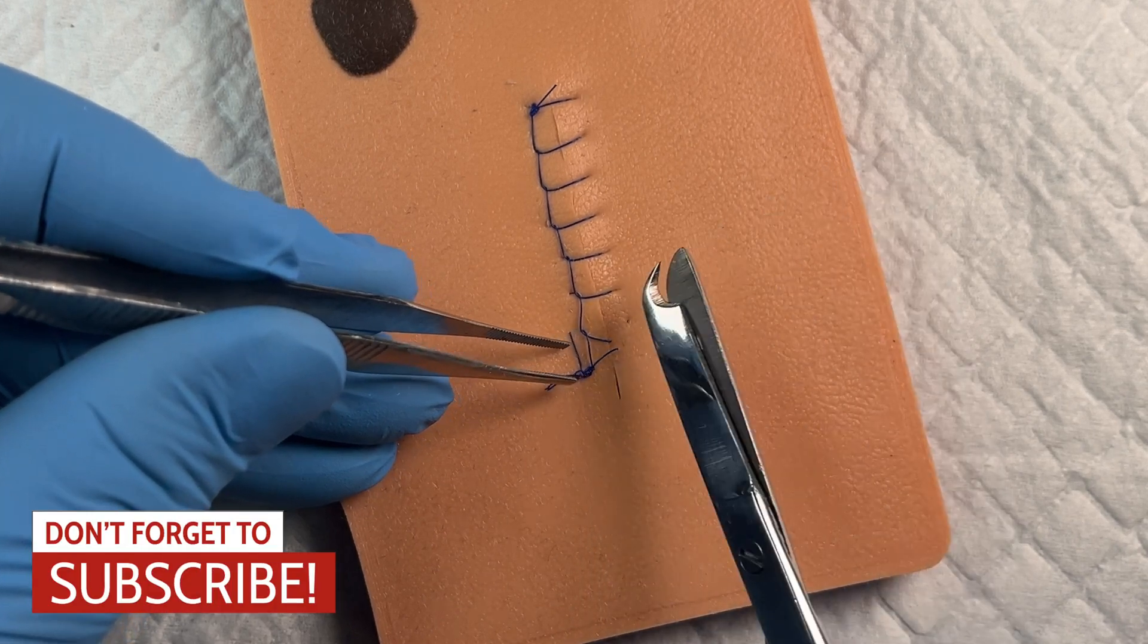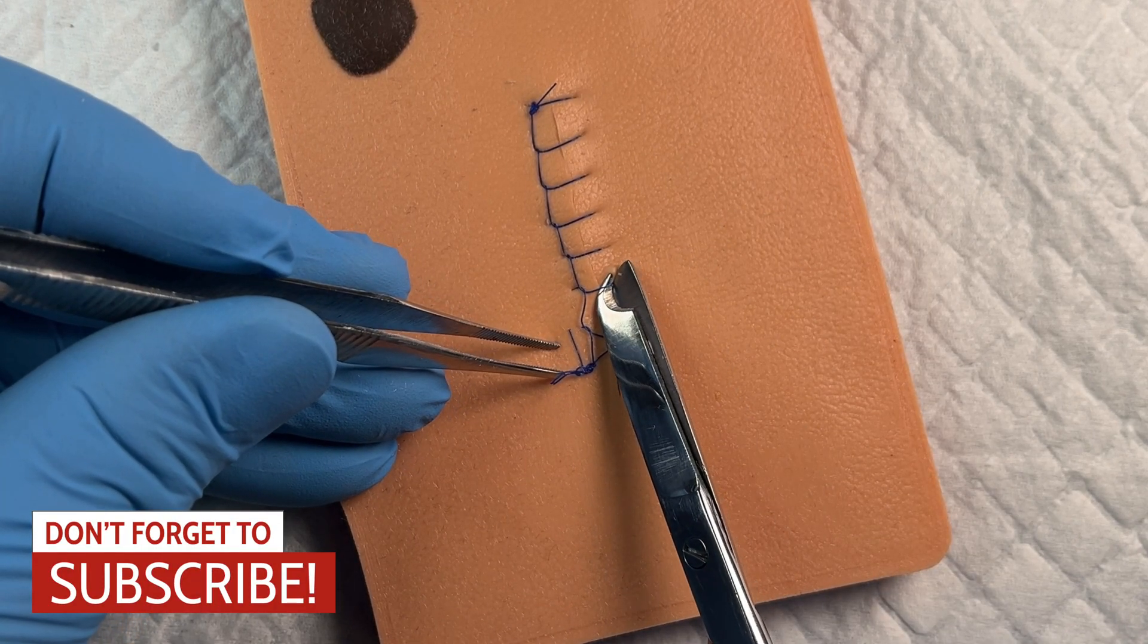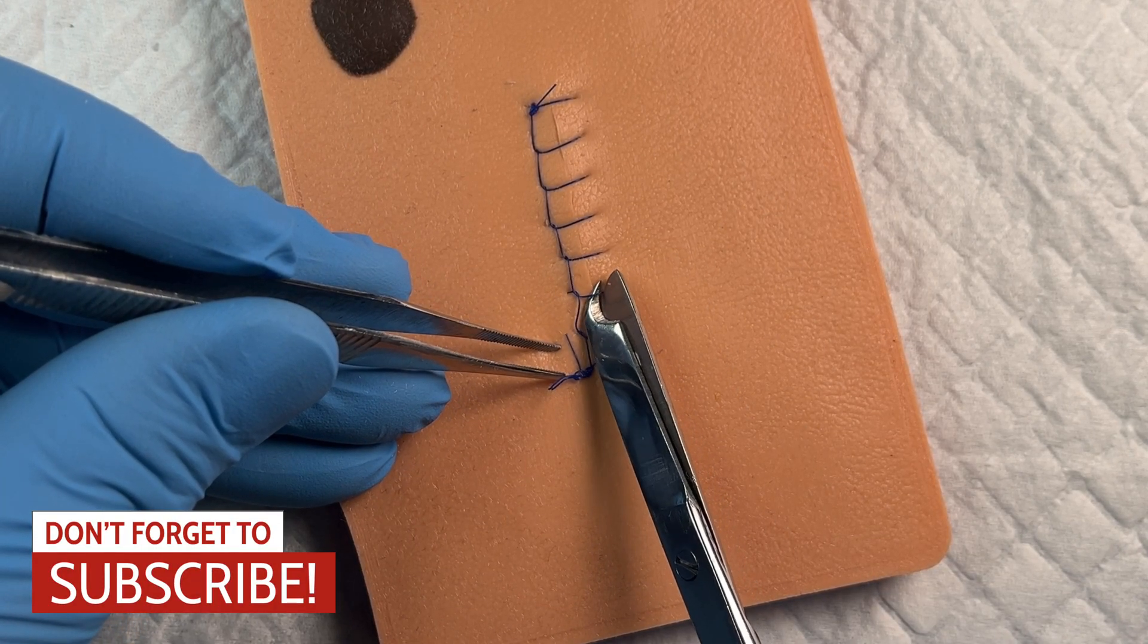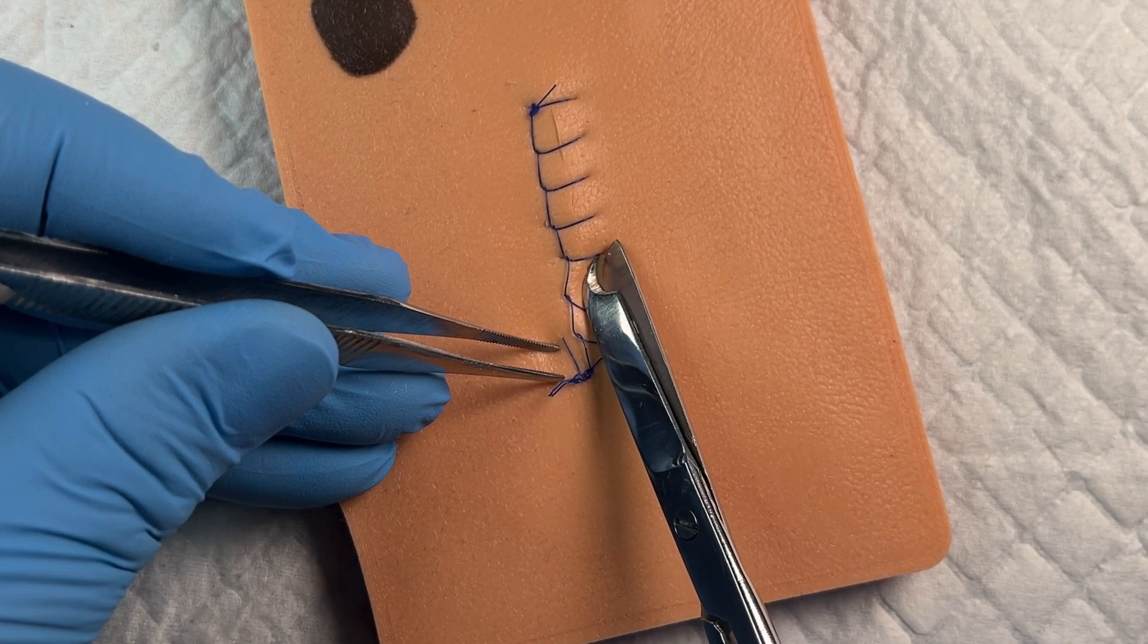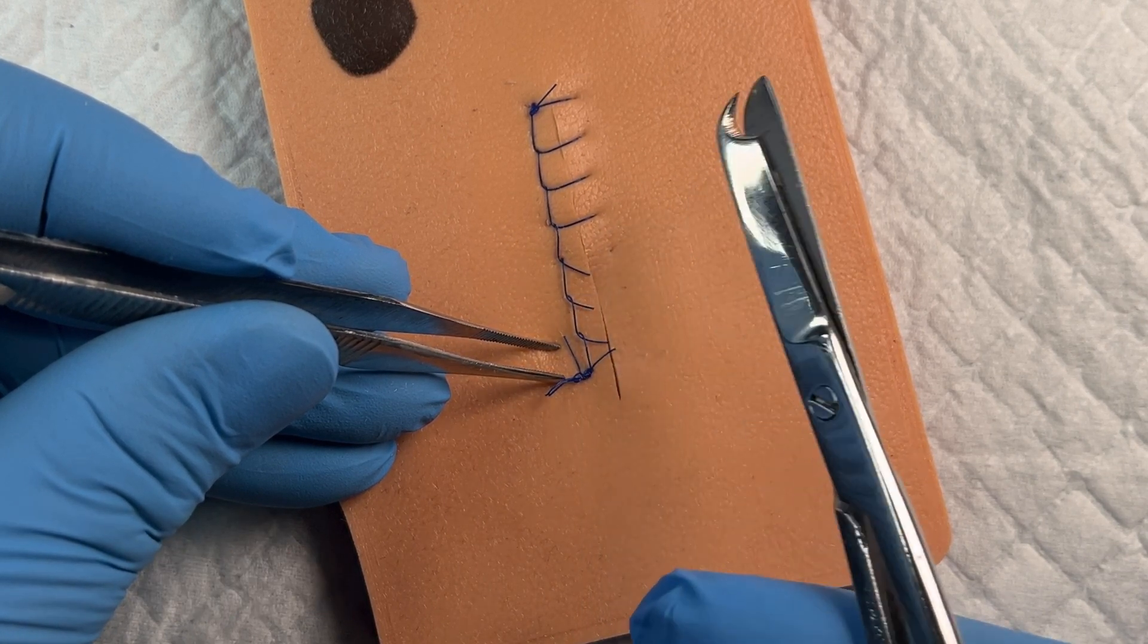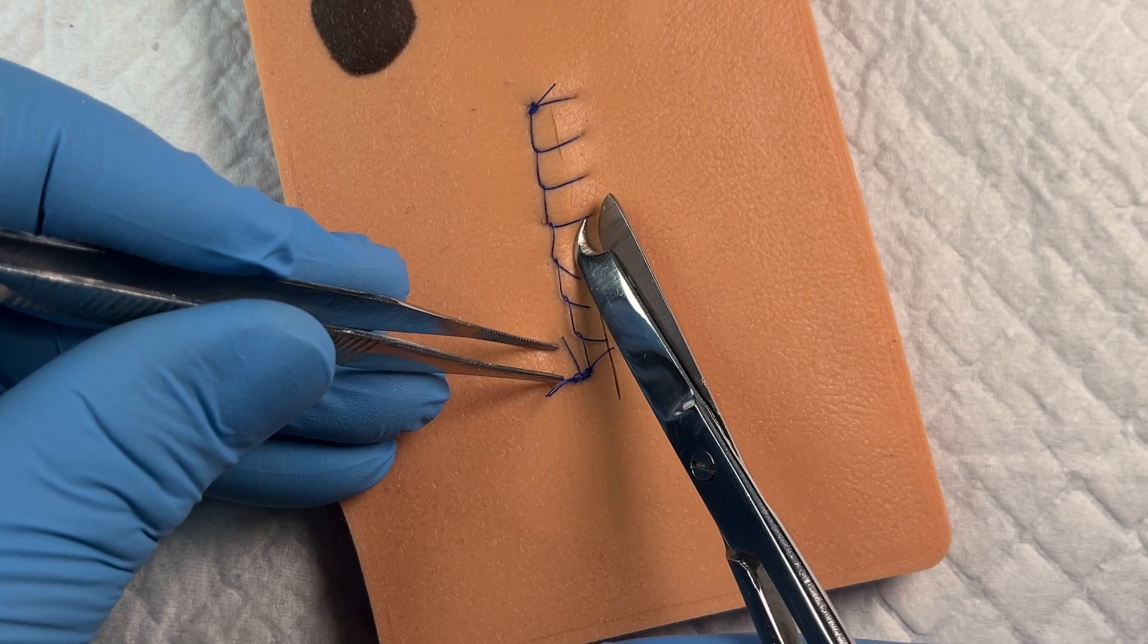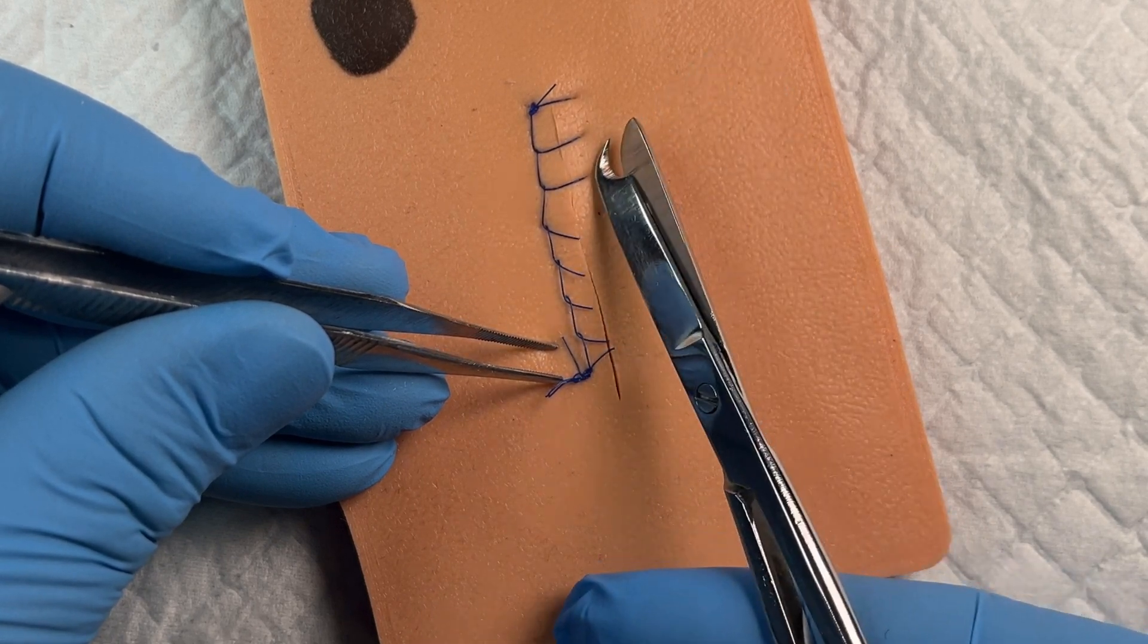at each one of these spots and notice that the suture that is already above the skin is going to stay above the skin and the suture that is within the skin is what gets pulled down in. And so we're avoiding dragging suture down through.